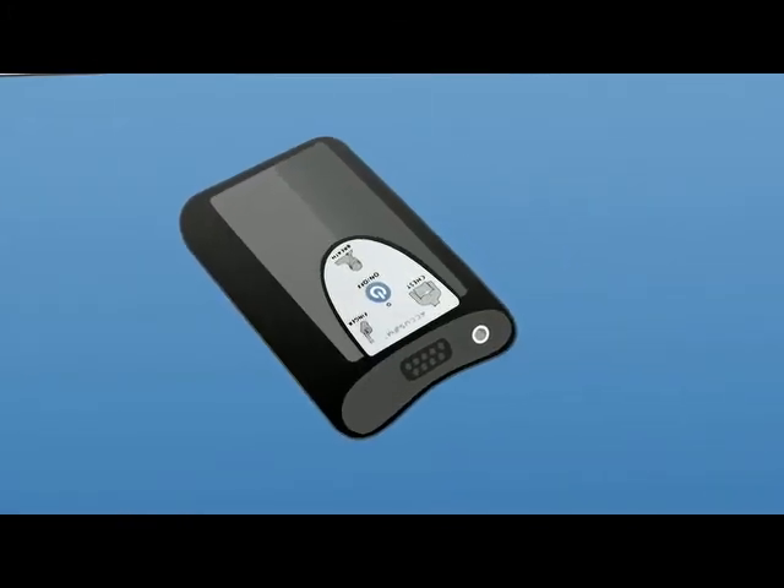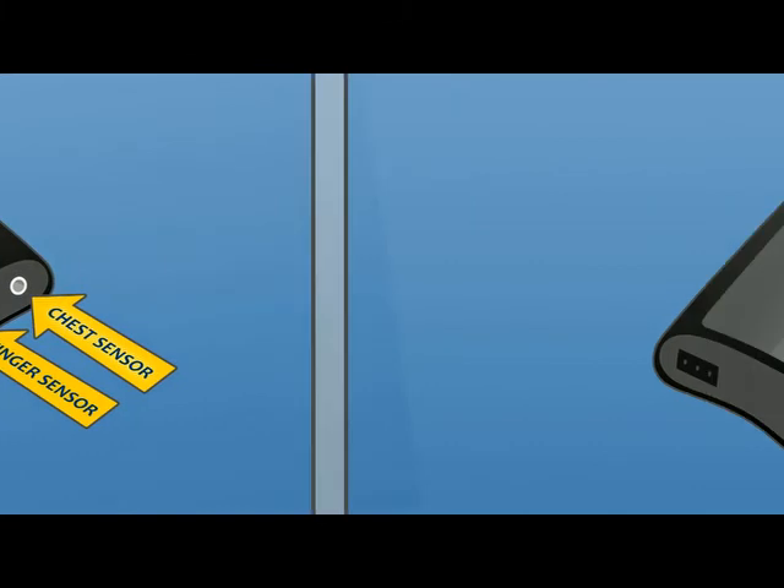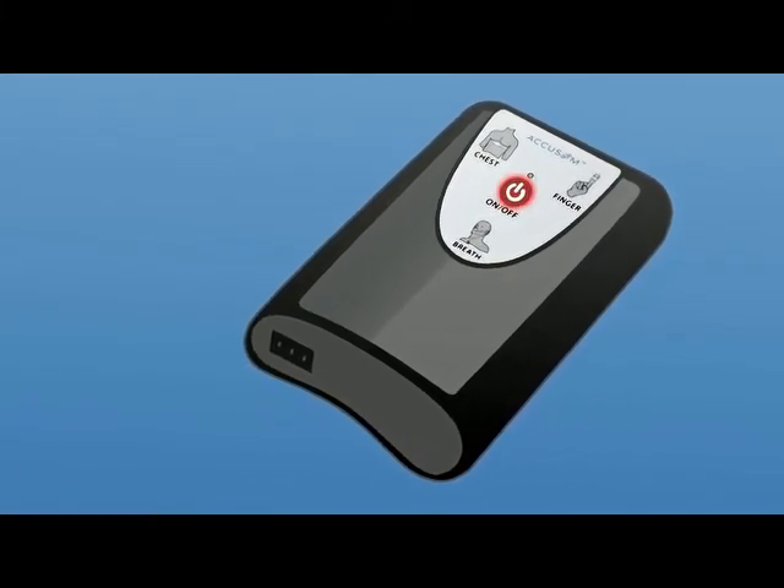The top panel has openings to attach the finger sensor and the chest sensor. The bottom panel has an opening to attach the breath sensor, and the on/off button is on the front panel.